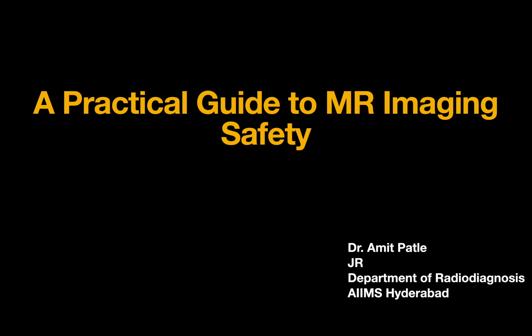I am a junior resident in the Department of Radiodiagnosis at AIIMS Hyderabad, and today we are going to discuss a practical guide to MR imaging safety. So we all know that image acquisition in MR imaging is unique and relies on subtle differences in intrinsic behavior of hydrogen protons bound to different soft tissue and fluids to produce image contrast. This requires use of strong magnetic fields and radio frequency coils, which presents a set of safety challenges distinct from those of all other radiological modalities.